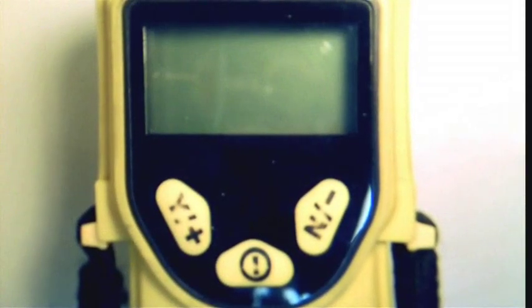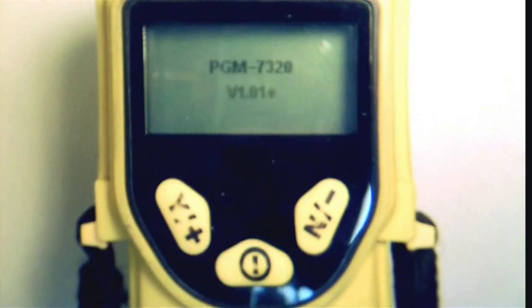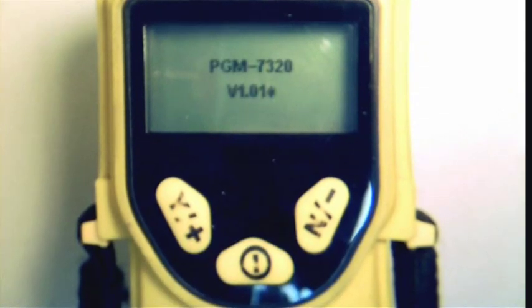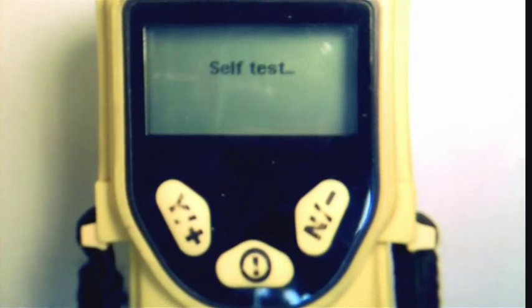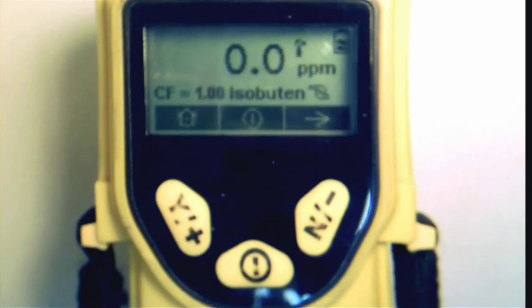To begin, the unit is turned on by pressing and holding the middle power button. Once the unit displays a reading, it is ready.